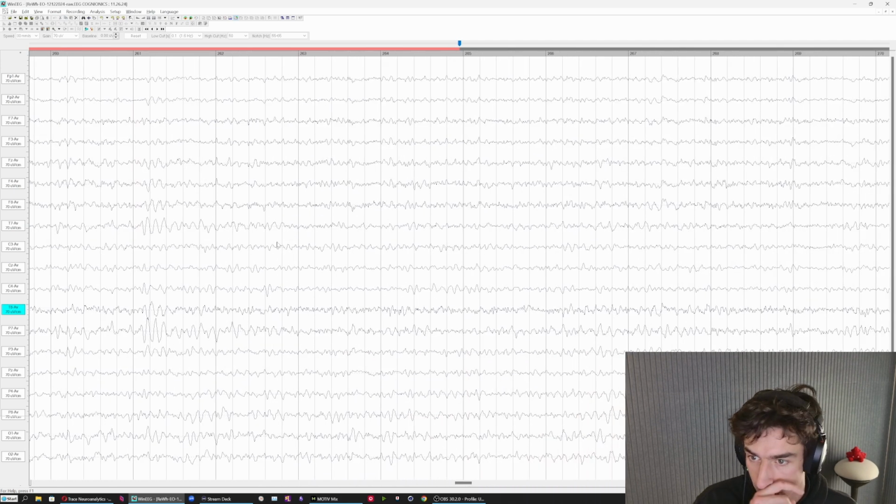Here's another example of this left posterior temporal alpha activity.